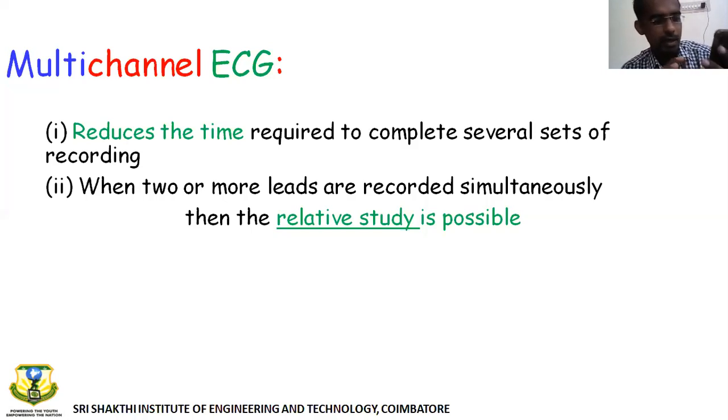Yeah, you can follow on my mobile, see, there are two screens parallelly, right? Now I can even go and browse here or even do this. So what I'm basically doing is, this is multi-channel, multiple screens in our mobile, right? So similarly, multi-channel ECG means simultaneously you can record two or more patterns at a time.